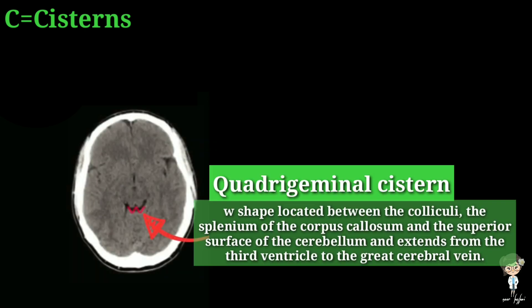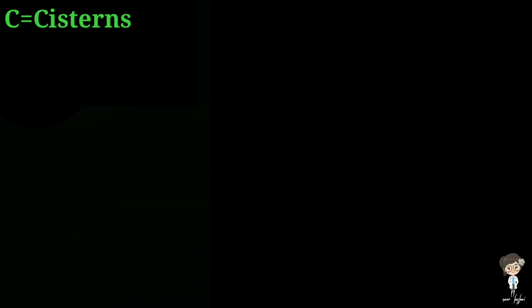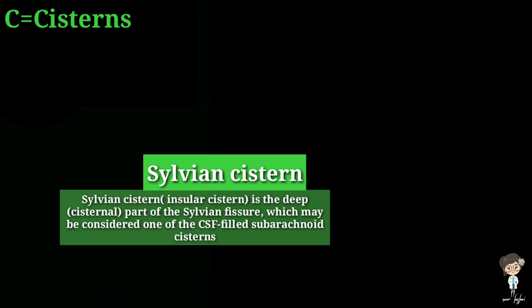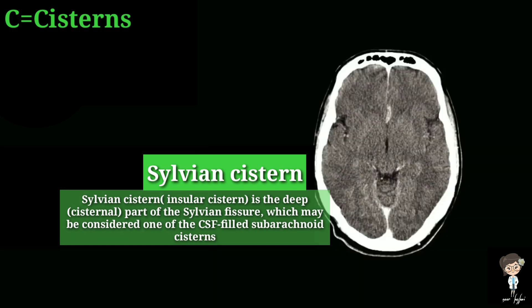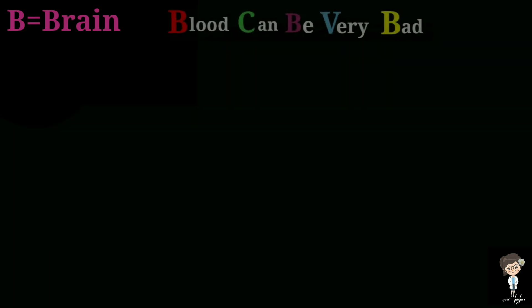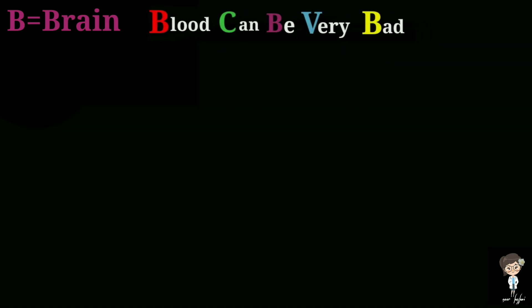The quadrigeminal cistern has a W-shaped appearance between the colliculi, the splenium of the corpus callosum, and the superior surface of the cerebellum, which extends to the third ventricle to the great cerebral vein. The sylvian cistern is the last and most important cistern to be seen on CT brain, also called the insular cistern, located in the deep part of the sylvian fissure between the temporal and frontal lobes.